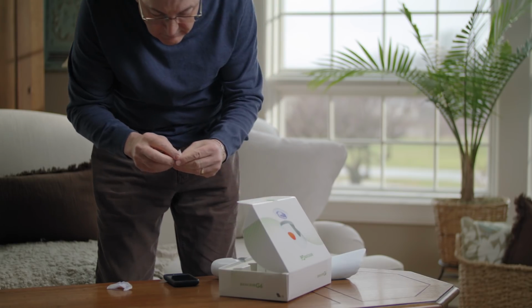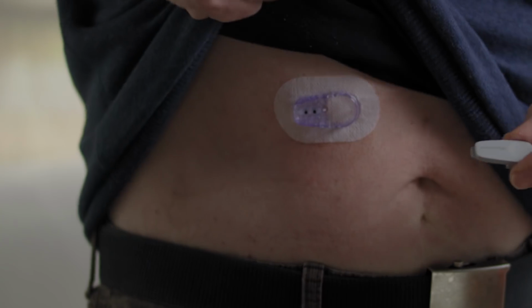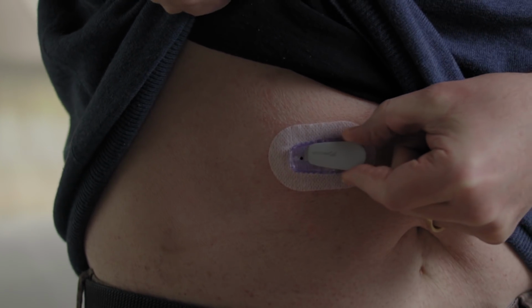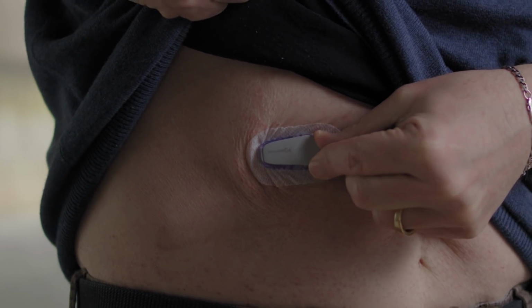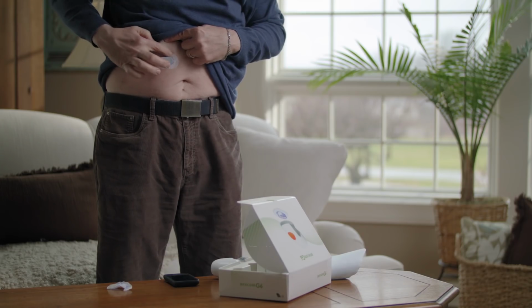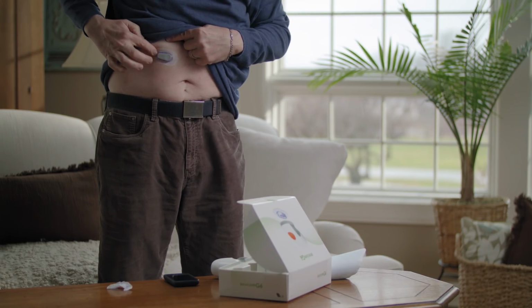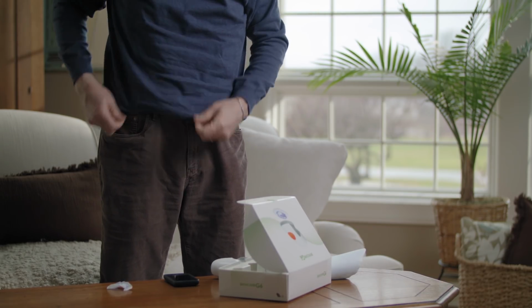Now it's time to attach the transmitter you removed. Clean your transmitter with an alcohol wipe and let it dry. Insert the transmitter tab into the slot. Snap the transmitter firmly into place. Rub around the patch 3 times. Once your transmitter is attached, you can swim, bathe, and shower like normal. You have successfully inserted your sensor and attached your transmitter.